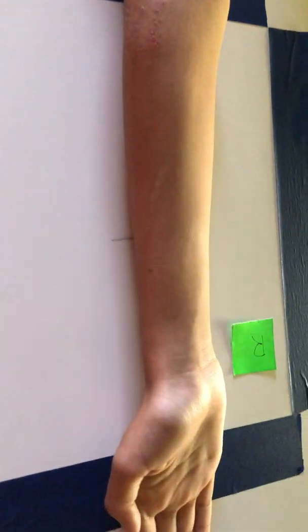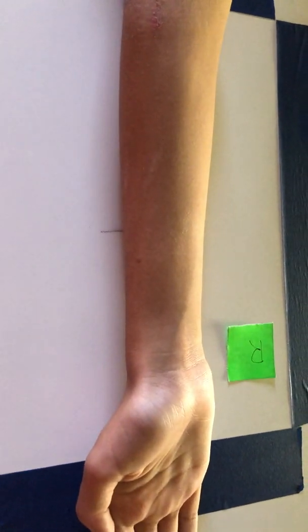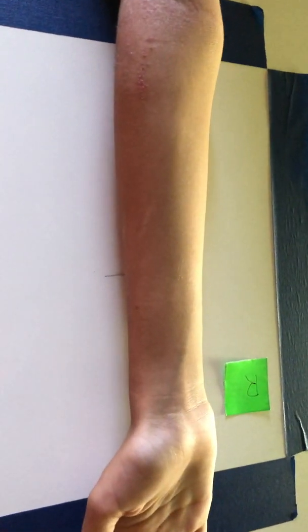So I'm going to have my person right there. This is the right arm, therefore I will use the right marker, and the cassette size is 14 by 17, 40 inches SID. There are no breathing instructions. The central ray is directed perpendicular to the midpoint of the field. We're trying to get the AP projection of the radius, ulna, and distal humerus, and/or proximal row of the carpal bones.